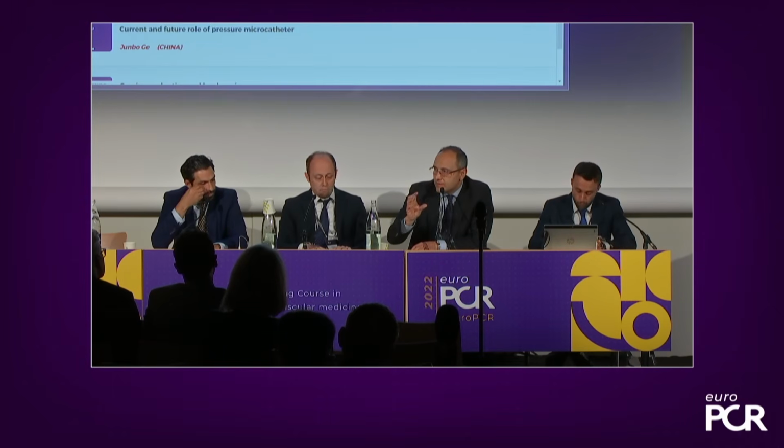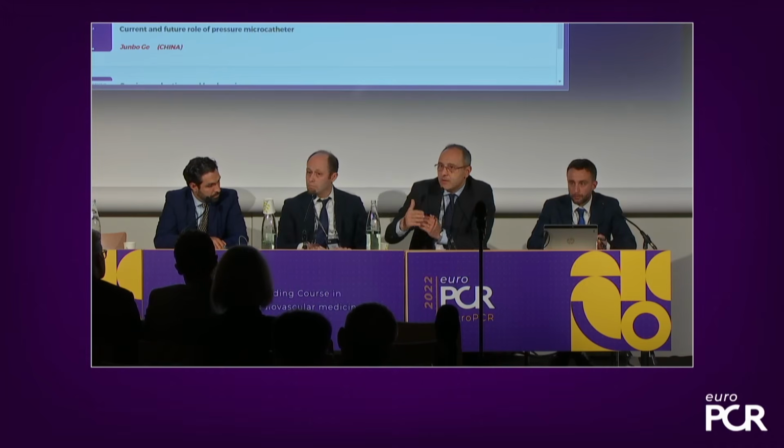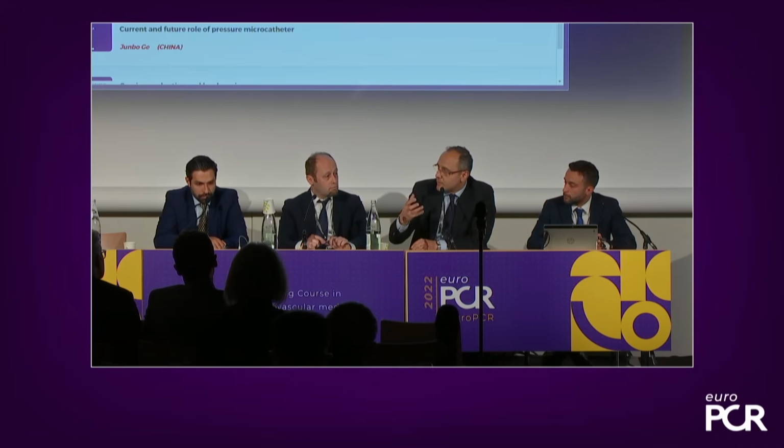It's totally right. Actually, this is something, as was mentioned in the beginning, that we should take into account from the very beginning, before even embarking on a percutaneous coronary intervention. If we realize that there is a focal stenosis on a background of diffuse disease, this can still be a case that we take for PCI, because you can at least help a little bit by restoring the flow segmentally in these vessels, taking into account that you will never be able to achieve a perfect result at the end. But having brought this patient with an FFR initially of 0.4 up to 0.86, 0.87, means a delta FFR that is massive. So for sure, we did something good for this patient.